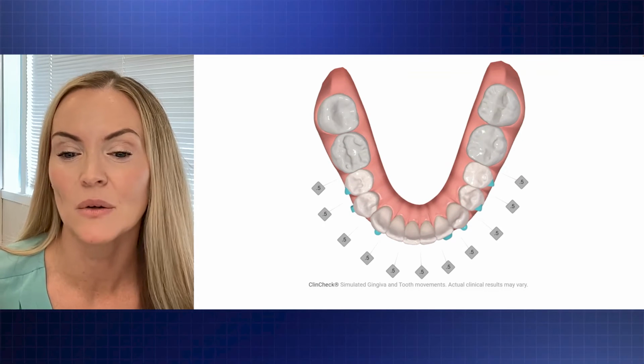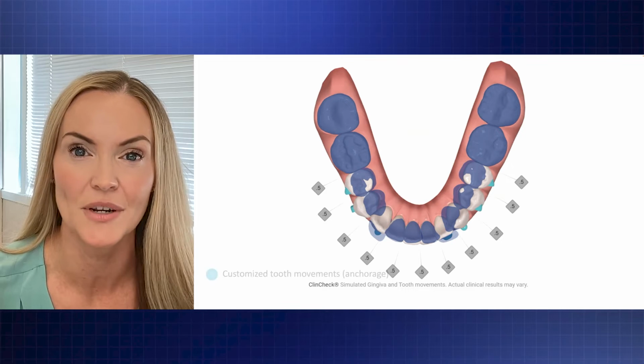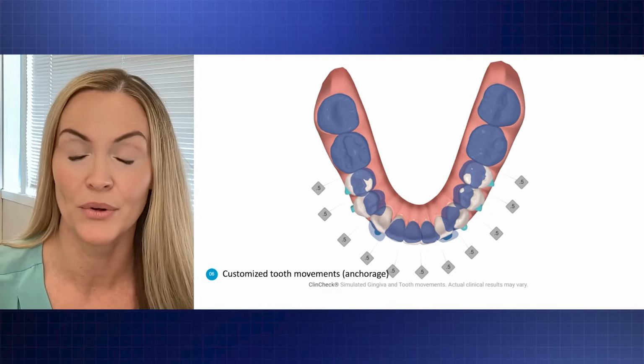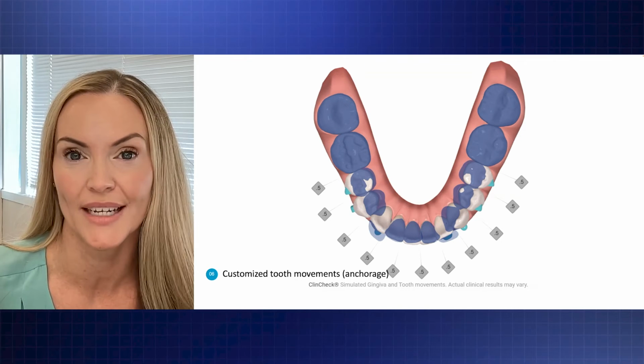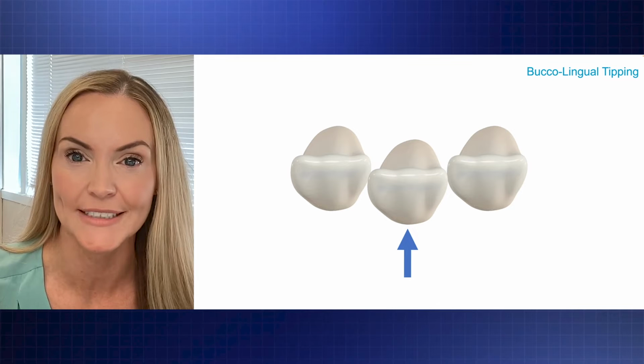So as you see, that lower incisor never had the opportunity to procline and have further recession during treatment. So we can customize the tooth movements, and they can provide us anchorage or provide us the support that we need when we have periodontally compromised patients.